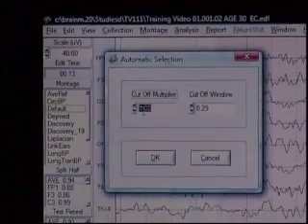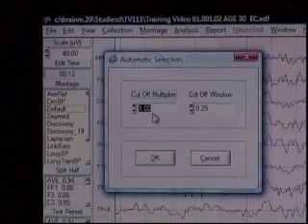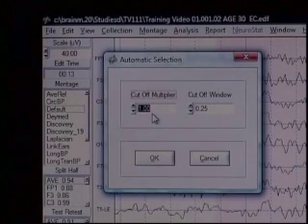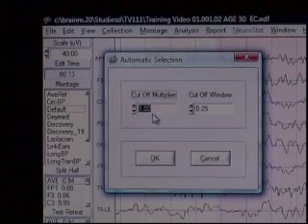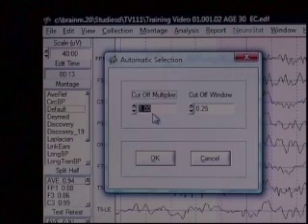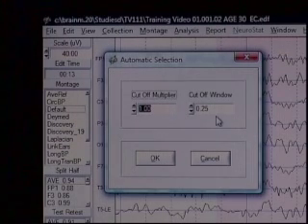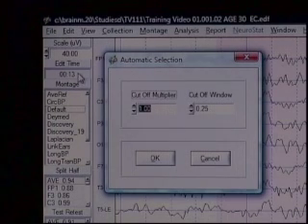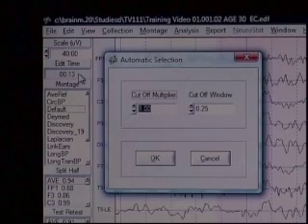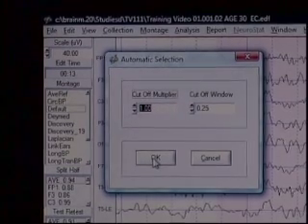It has a cutoff multiplier of 1, and I'm going to leave it at 1. That means it's going to choose typical EEG based on what I picked. It has a window of 0.25 — I'll leave those as default. When I press OK, let's watch what happens to the edit time; it's 13 seconds now.